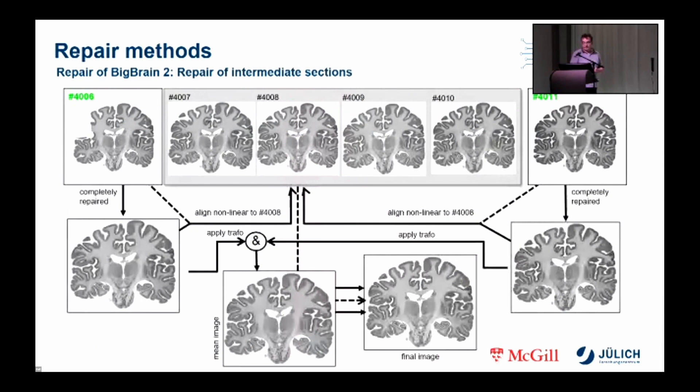For the repair of intermediate sections, an automatic method was implemented which builds on already completed repaired sections. In the example shown, the unrepaired as well as the manually repaired sections 4006 and 4011 were non-linearly transformed to the intermediate section 4008. In the same way, all intermediate sections are repaired with the help of the two nearest sections from the series of completely manually repaired sections.